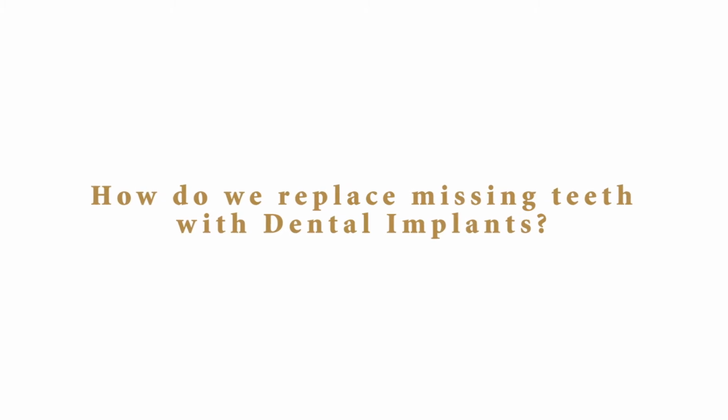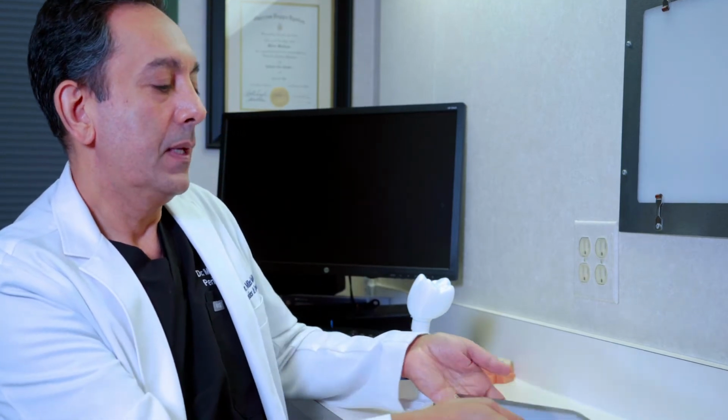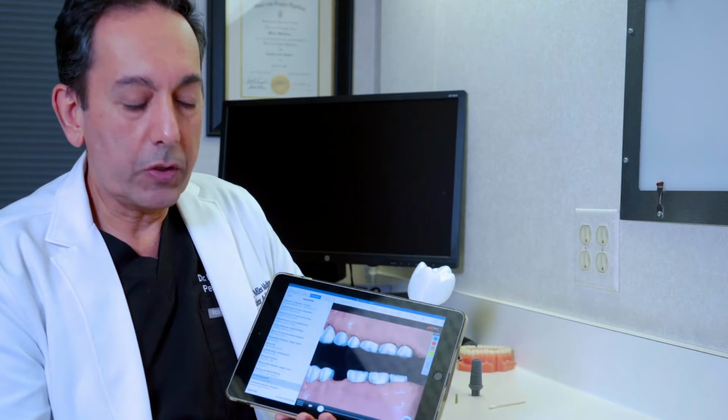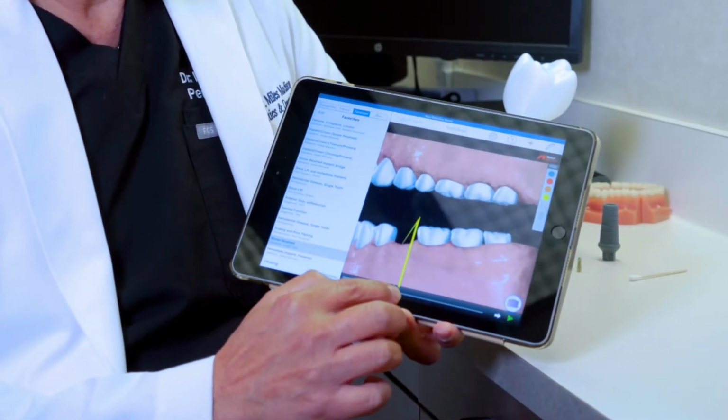What I want to talk about is how we replace missing teeth with dental implants. Now, dental implants have been around for more than 40 years now, so it's a very proven method of replacing teeth. So what I'd like to do is show a schematic of how this is done. So we're going to focus on this area of a missing tooth on the lower jaw. And what we're going to look at is a cross section of that area.